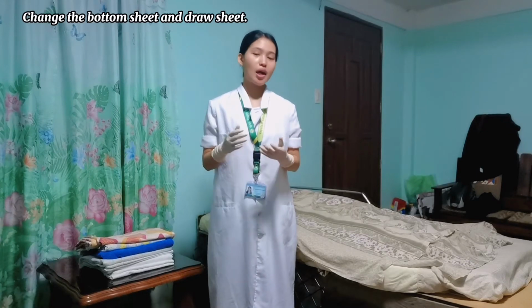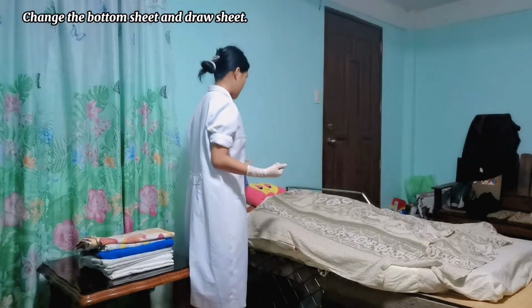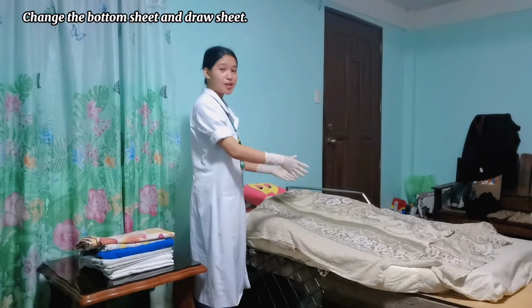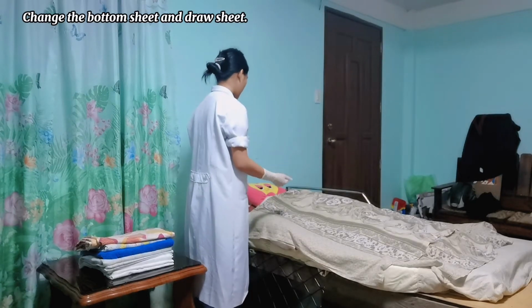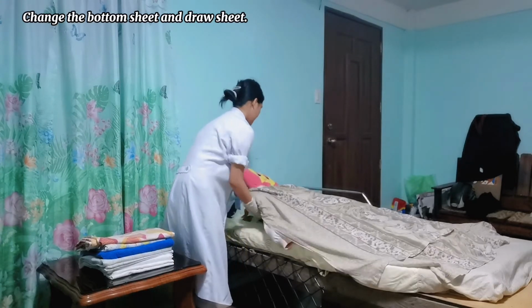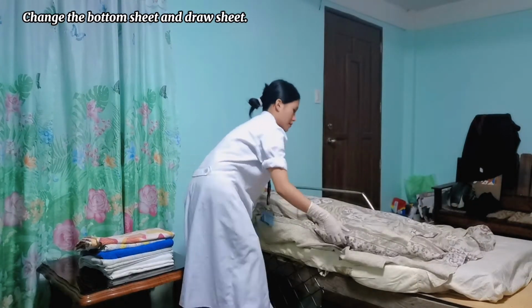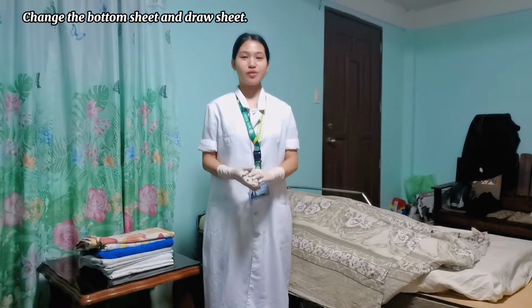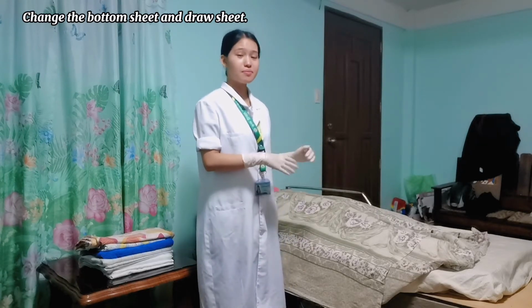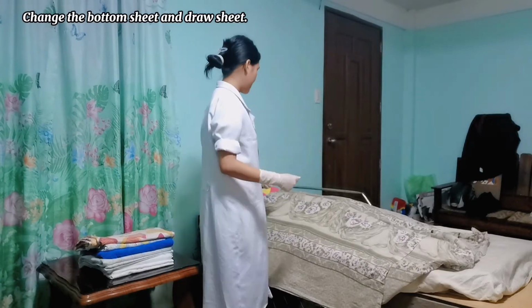Now we are going to instruct the patient to move closer to me and move him in three sections, the upper, the middle, and the lower. Closer only. I want you to move closer to me. So the next one is we are going to instruct the patient to cross his legs and position his arms, and assist the patient to move to the far side of the bed.